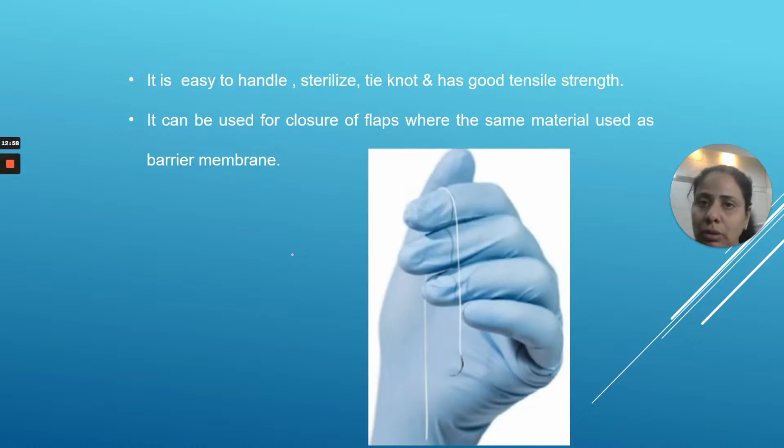Although it is a very costly suture, you should keep at least one in your practice, especially if you are doing implant cases or bone grafting cases, so that you know these are the sutures which will really hold your membrane or material or blocks together very well. So enough about PTFE, because you cannot routinely use this material. These are very costly sutures.